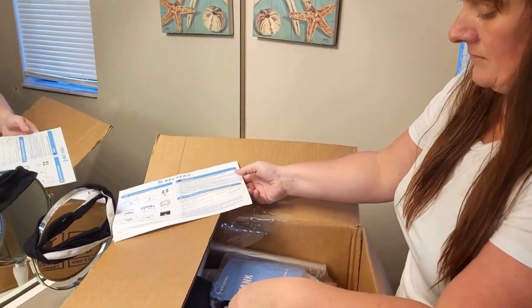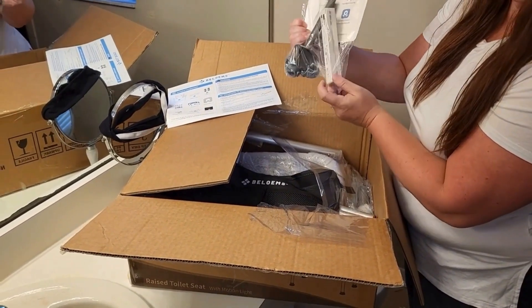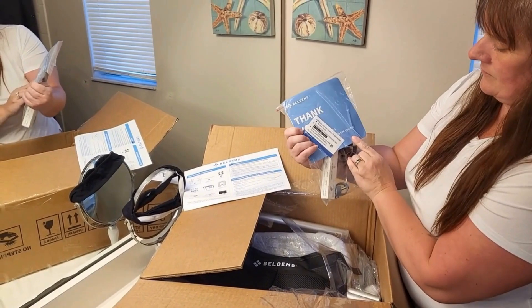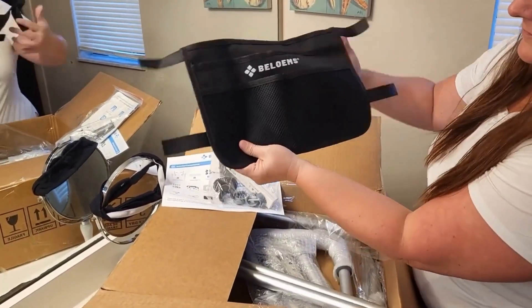It looks like it comes with a set of instructions and there are no tools needed in order to put this all together. It's an easy snap and there are some magnets. I really like the fact that it came with a pouch.